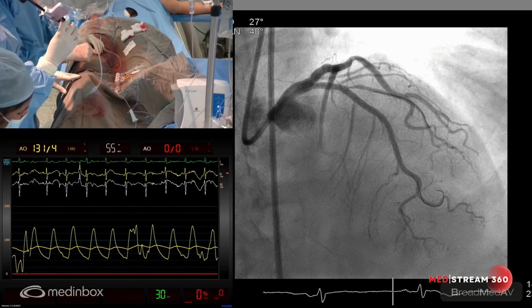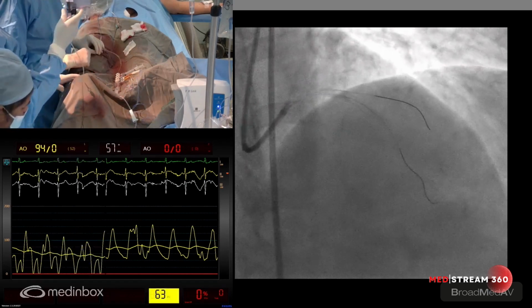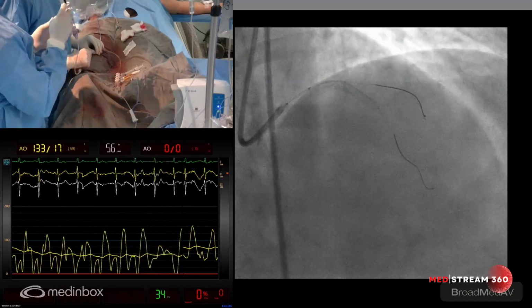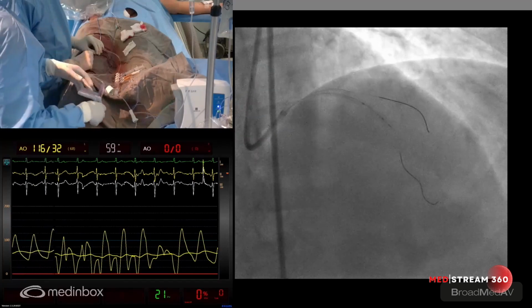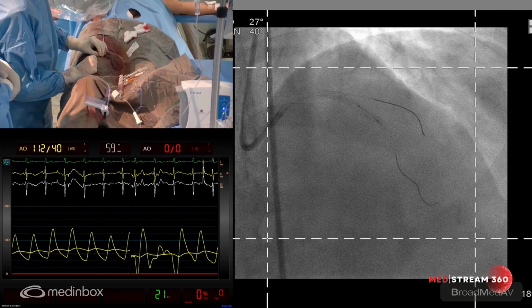Rahul is asking me a question whether we should remove the wire in the diagonal when you're doing the proximal. I don't think anything will happen, even though it's a hydrophilic wire. We'll just take a stent boost here.